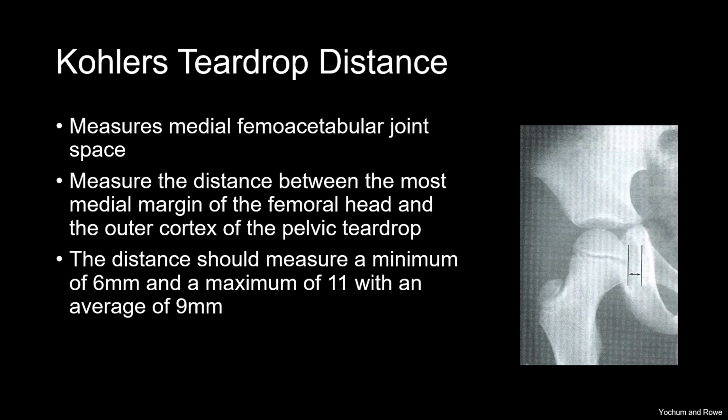Kohler's teardrop distance is used to measure the medial joint space of the femoral acetabular joint. You draw a line at the lateral margin of Kohler's teardrop and then the articular surface of the femoral head and measure that distance.